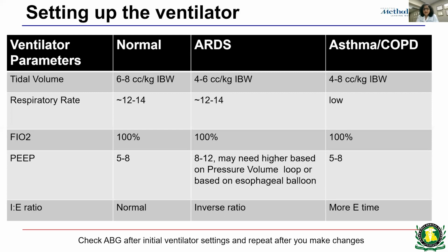You must always check an ABG after the initial ventilator settings and then repeat it after you make any changes to the ventilator.